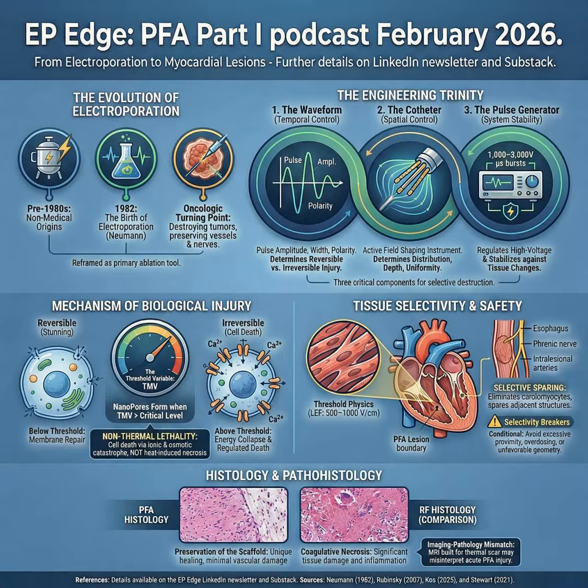Then catheter-based strategies evolved in stages, each one solving one problem and creating another. One of the most fascinating moments in that story is how direct current ablation entered the picture. DC ablation was, in part, discovered through an accident. In the late 1970s, in a European EP lab, a patient with unstable ventricular tachycardia was undergoing catheter work. A catheter position inadvertently shifted, essentially to the His region, and a short circuit occurred with the defibrillator system. The outcome was complete heart block.